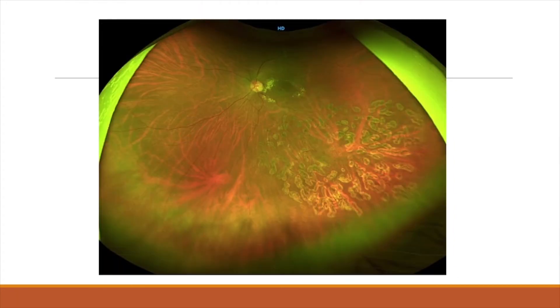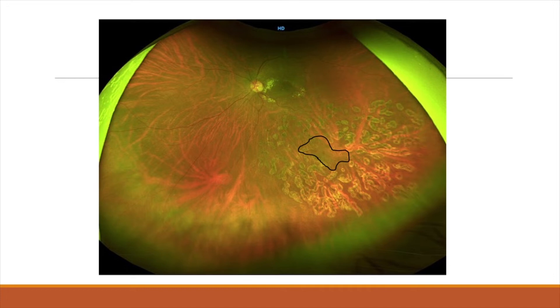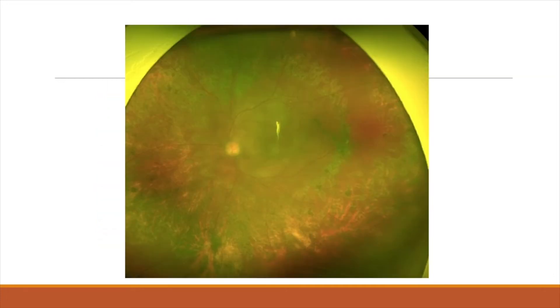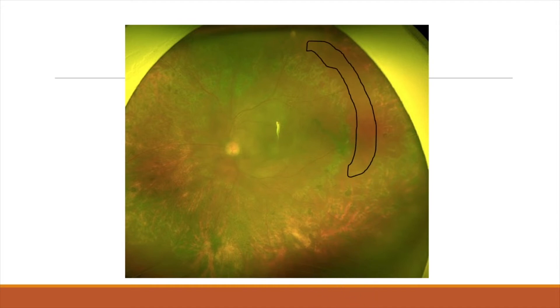That area was filled in. In an inferotemporal BRVO patient with chronic CME, there was one streak of subhyaloid hemorrhage associated with NVE, so laser was filled in exactly in that area. Another patient showed the skip area clearly visible in the superior and temporal quadrant, and that area was filled in.